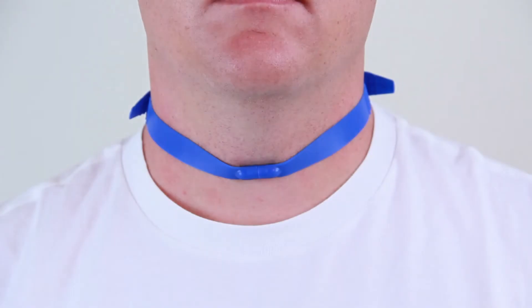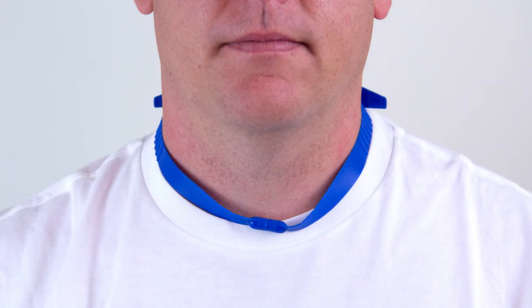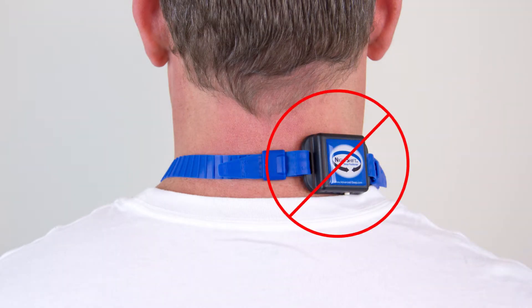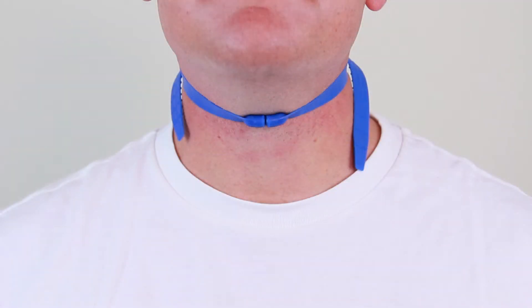The strap must be adjusted so it is comfortable yet secure, similar to a buttoned collar. If worn too loose, the Night Shift could slip from the center on the back of your neck, resulting in incorrect detection of back sleeping. If adjusted too tight, the magnetic clasp may disconnect and the device could fall off during sleep.